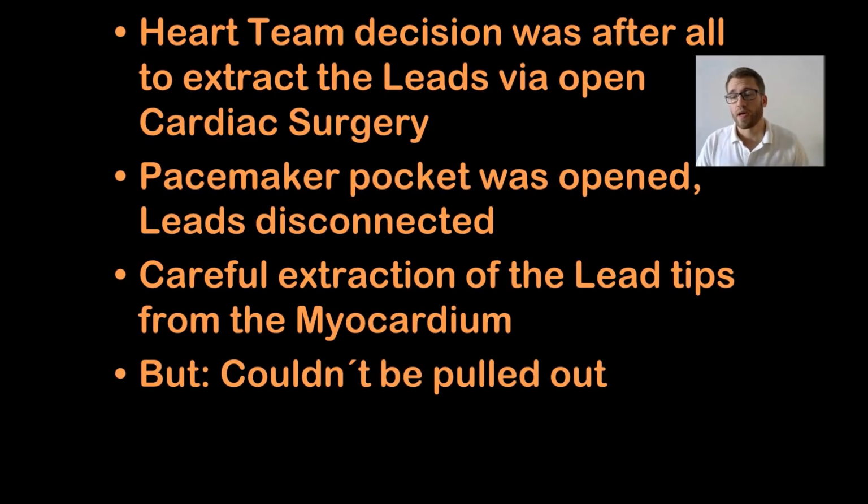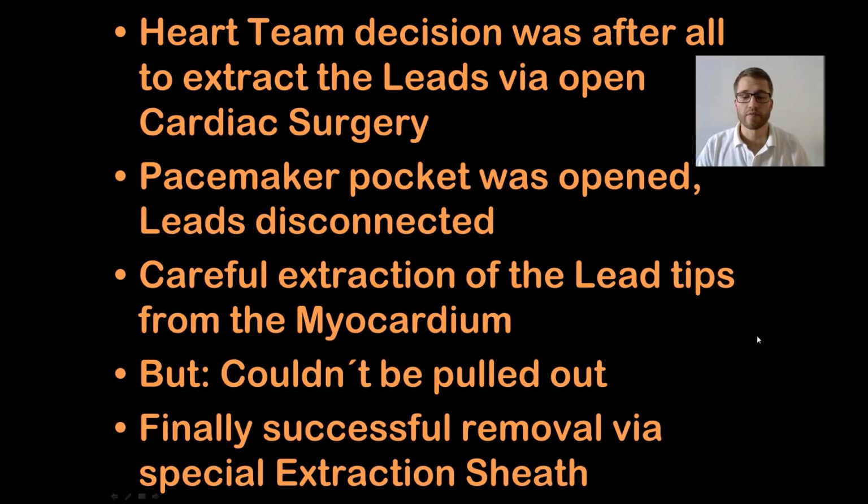So after all, it was a joint venture of the heart surgeons and the interventional cardiologists, and finally the leads could be extracted via a special extraction sheath without a part of the structure getting loose and causing another pulmonary embolism. So everything went fine for the patient.